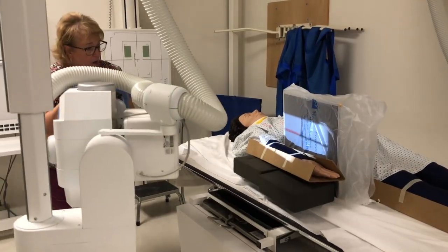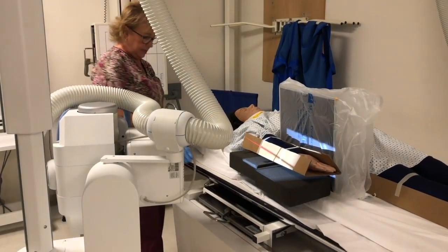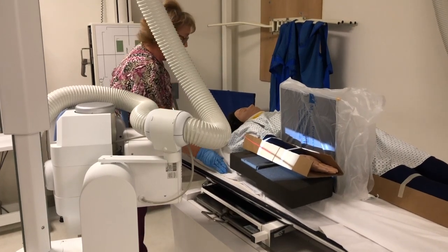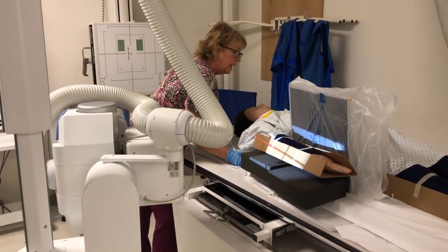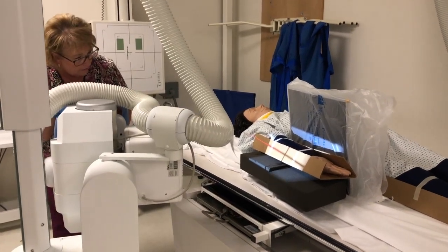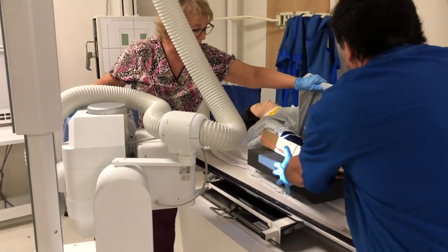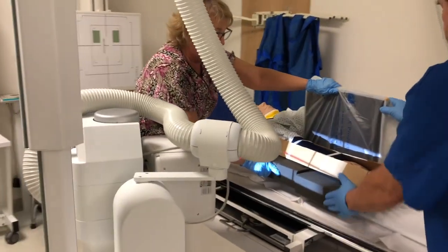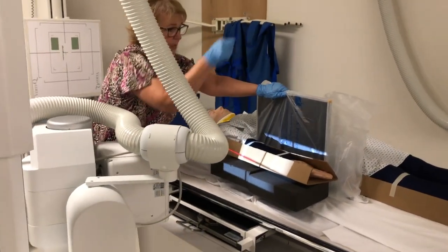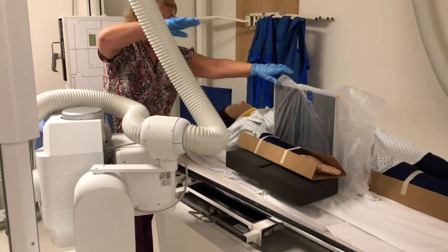Now we're setting up for our cross table forearm. Again, I don't quite have 40 inches, but sometimes you are in a situation where you can't get the ideal SID, but we do the best we can. So this is a situation where, you know, if I had medical tape, I would run it from one side of the bed to the other to ensure that the cassette stayed in place.